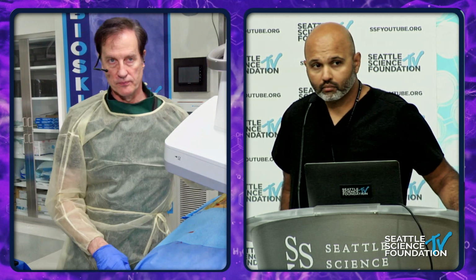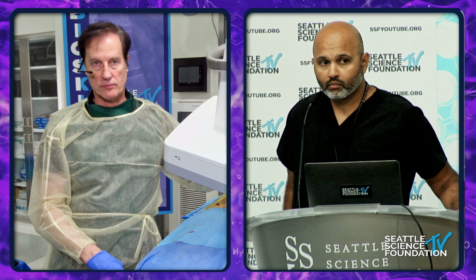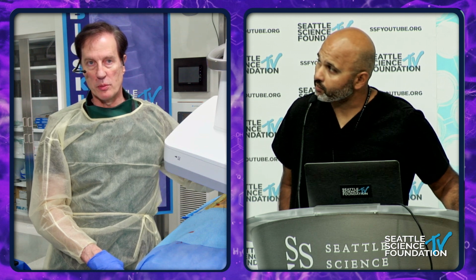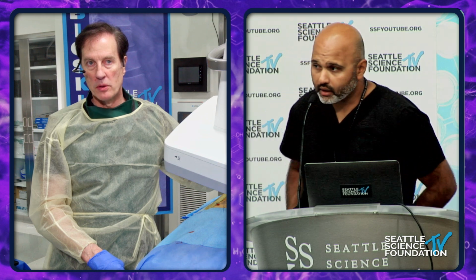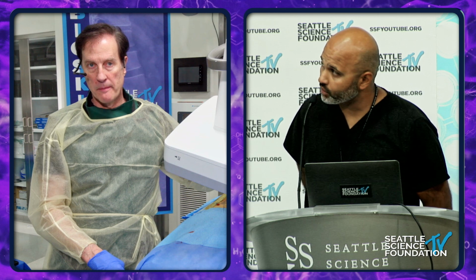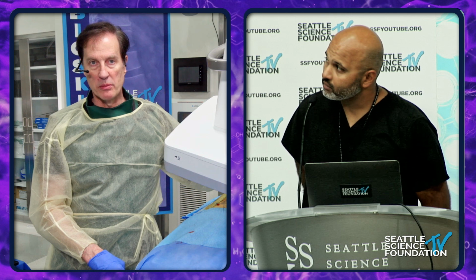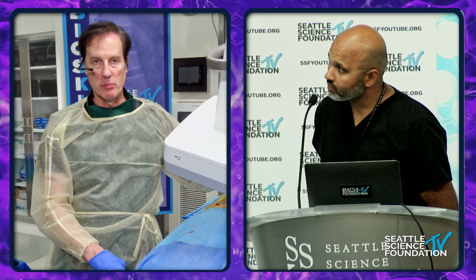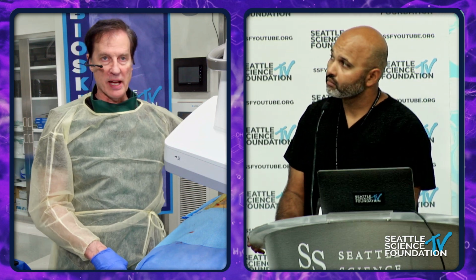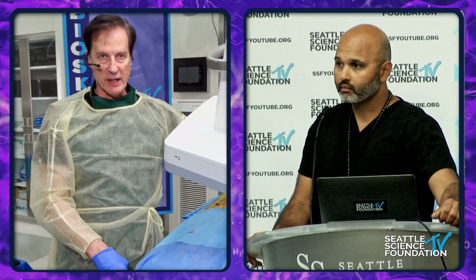Is this primarily a technique for people who are post-lumbosacral fusion, or also just de novo SI joint dysfunction, no previous history? He's asking if this is primarily done on patients who are post-lumbosacral fusion or just de novo SI joint dysfunction. No, there's got to be a reason. Somebody comes in and they haven't had surgery, they're male, they're younger, and they have SI joint pain. That doesn't happen, really. Of course it does, but that's very, very unusual.